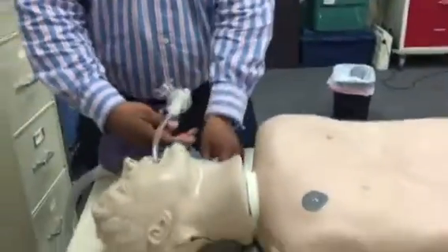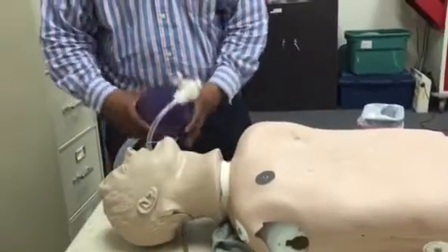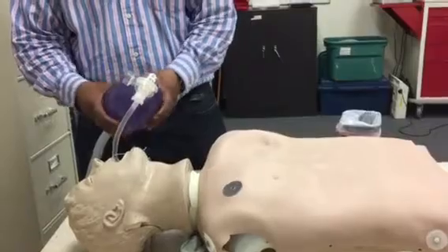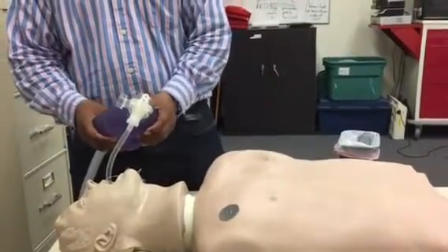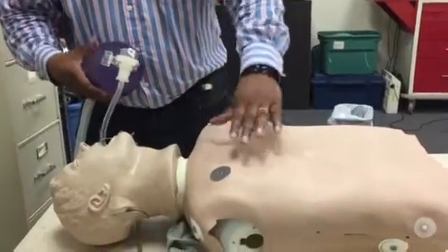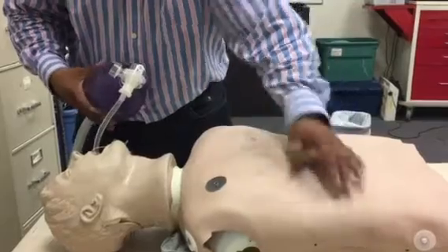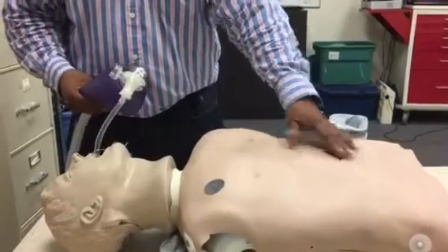I have it. You do have chest rise. I'm going to inflate the cuff. Now you do have very good chest rise since we have the cuff on the endotracheal tube inflated to 10cc. So we'll do the apices, axillary bases, and then we'll also do the epigastric area.